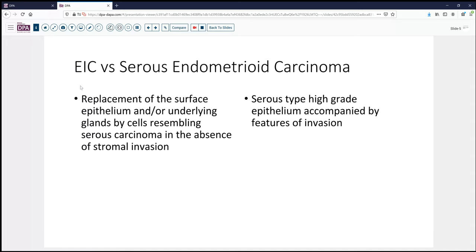Is it endometrial intraepithelial carcinoma (EIC), or is it serous endometrioid carcinoma? EIC is defined as replacement of the surface epithelium or underlying glands by cells resembling serous carcinoma in the absence of stromal invasion. Certainly on the surface of this polyp, we have not seen stromal invasion. To call it serous carcinoma, we should generally see features of invasion.